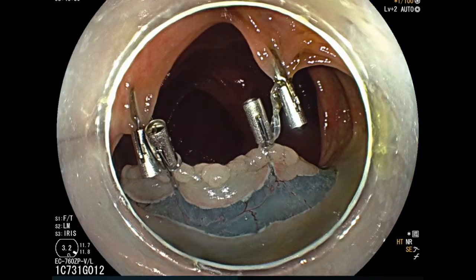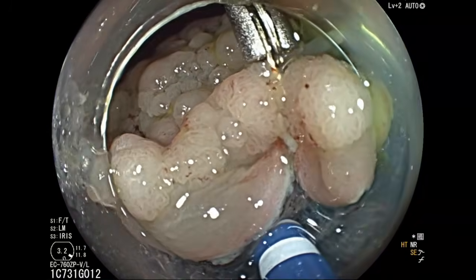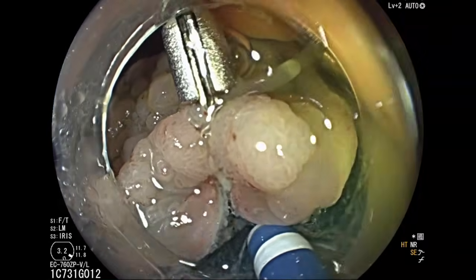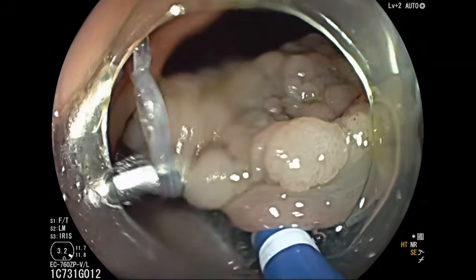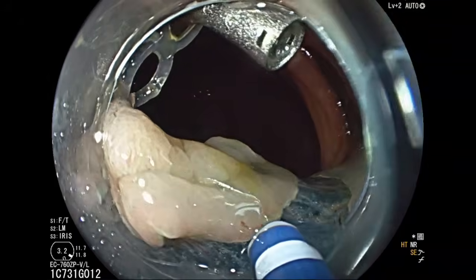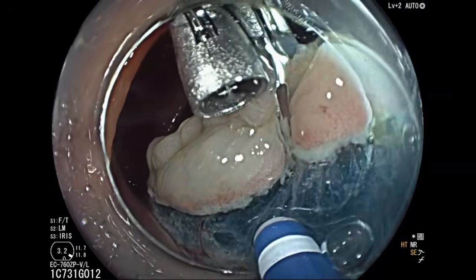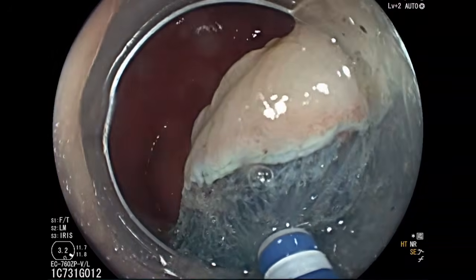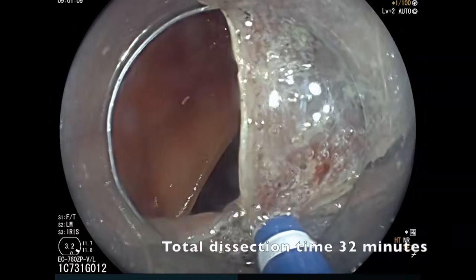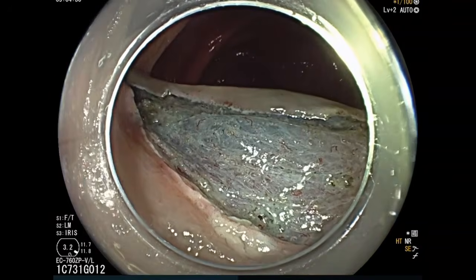Submucosa was better exposed after traction, and therefore we started the submucosal dissection initially at the highest traction or tension point. This will allow us to sequentially open the submucosal plane and safely complete the submucosal dissection. Submucosal trimming: the submucosal space was widely open, allowing us to complete the submucosal dissection using CO2 or underwater to control the level of the tension. After completing the dissection, the mucosal defect was examined carefully without any signs of deep mural injury.